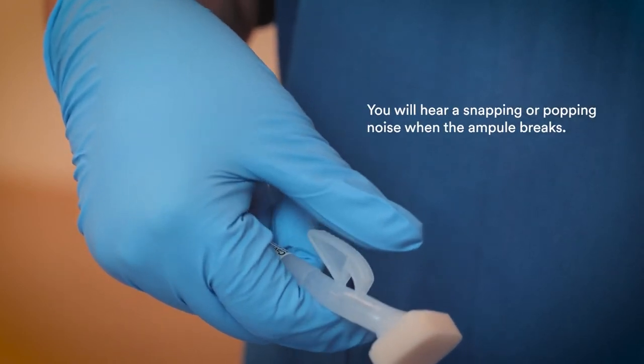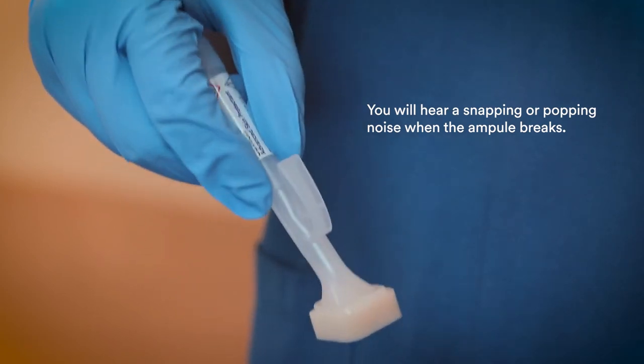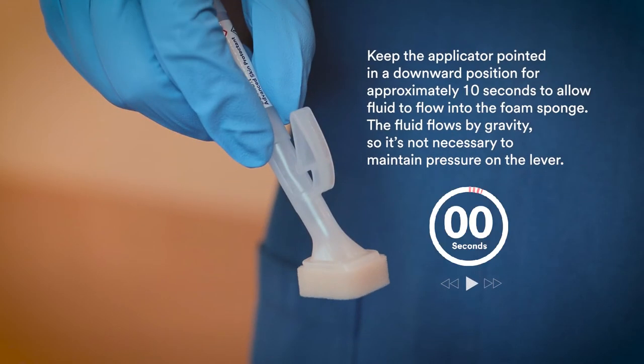You will hear a snapping or popping noise when the ampule breaks. Keep the applicator pointed in a downward position for approximately 10 seconds to allow fluid to flow into the foam sponge. The fluid flows by gravity, so it is not necessary to maintain pressure on the lever.